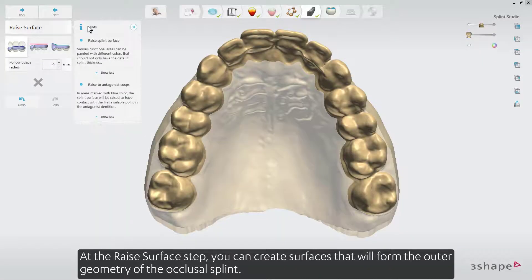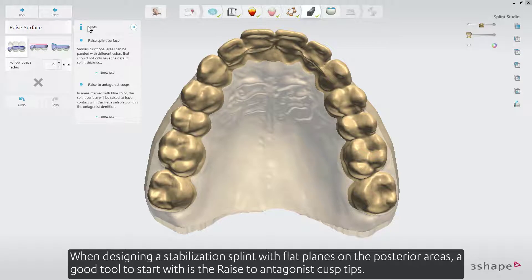At the raise surface step, you can create surfaces that will form the outer geometry of the occlusal splint. When designing a stabilisation splint with flat planes on the posterior areas, a good tool to start with is the raise to antagonist cusp tips.